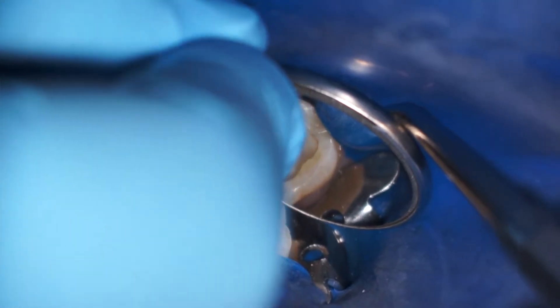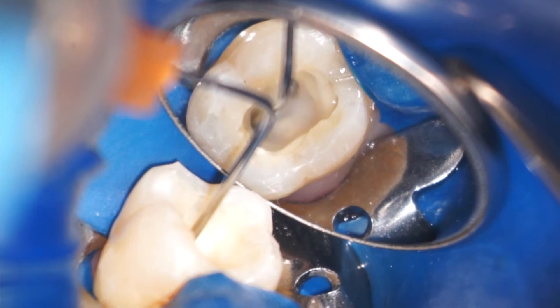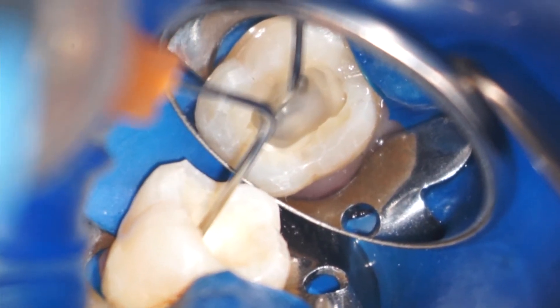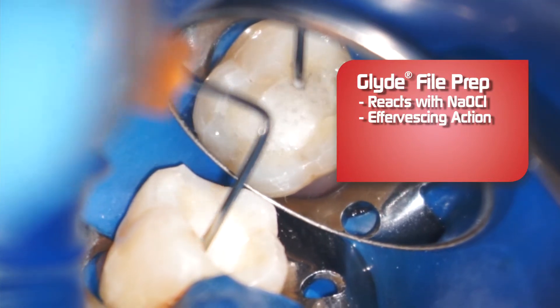When I'm working in a difficult calcified canal, I will go back and forth between Glide and sodium hypochlorite. Let me show you why. Here you can see, when I add some hypochlorite to the canal space, it reacts with the Glide, creating an effervescent action.